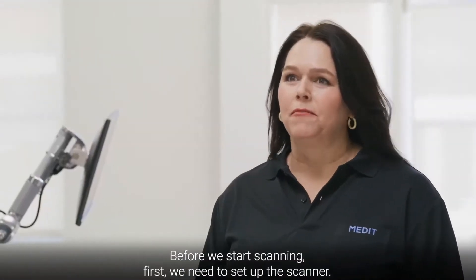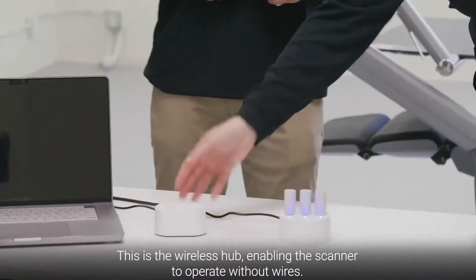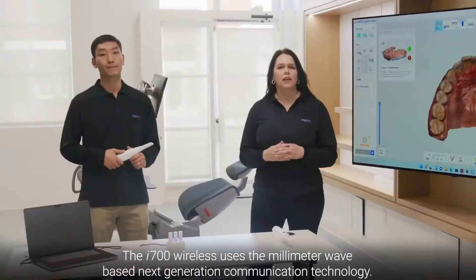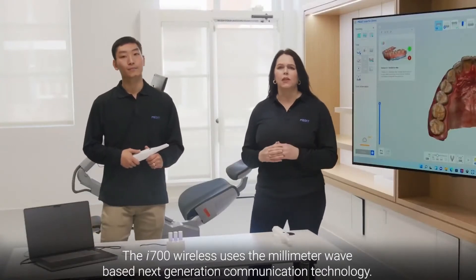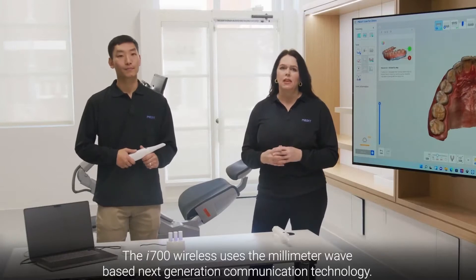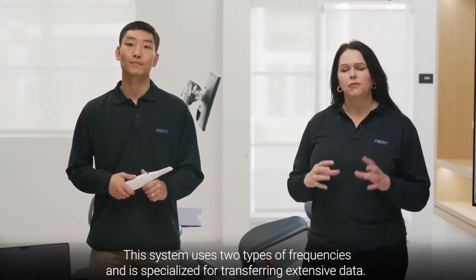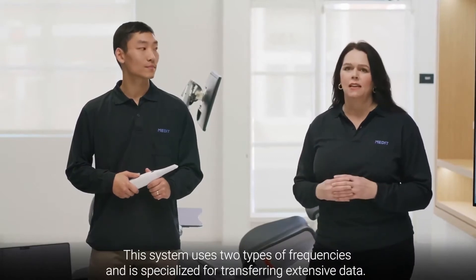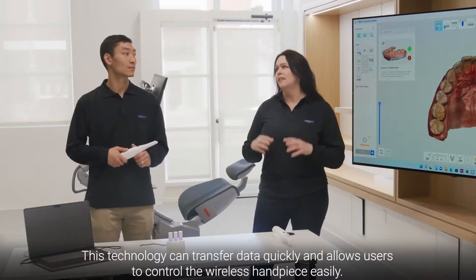Before we start scanning, we need to set up the scanner. This is the wireless hub, enabling the scanner to operate without wires. The i700 Wireless uses millimeter wave-based next generation communication technology. This system uses two types of frequencies and is specialized for transferring extensive data, allowing users to transfer data quickly and control the wireless handpiece easily.